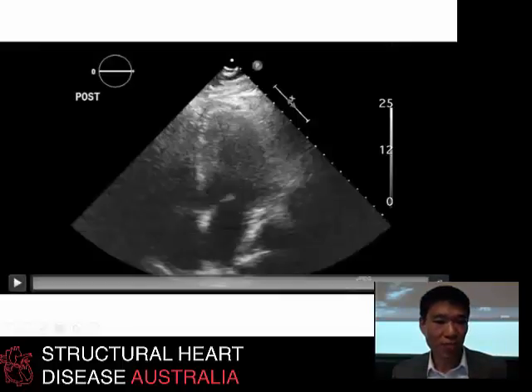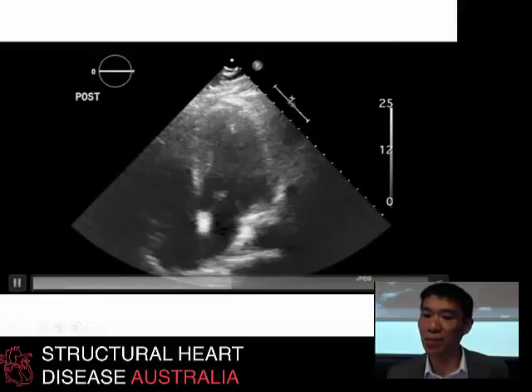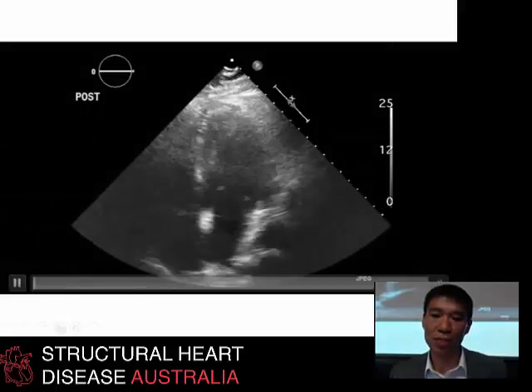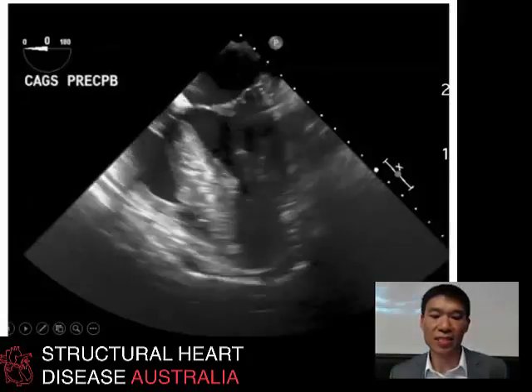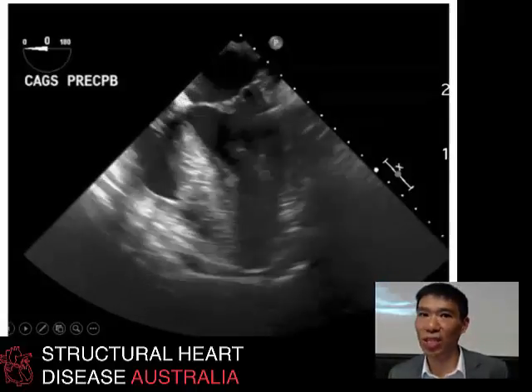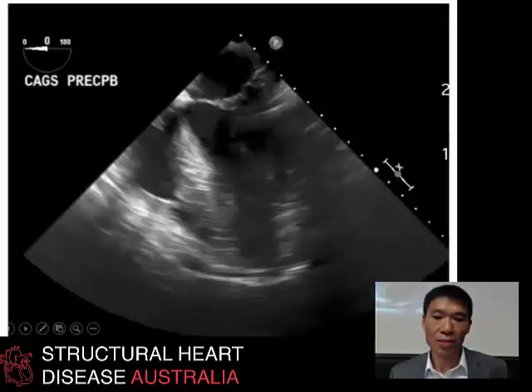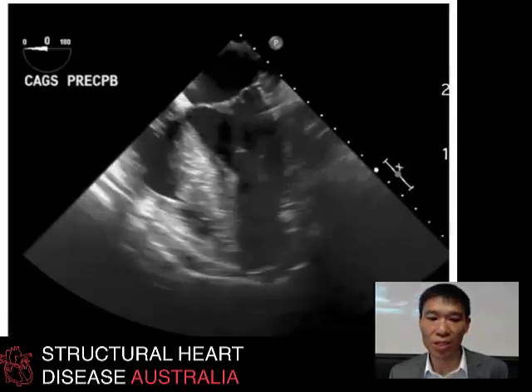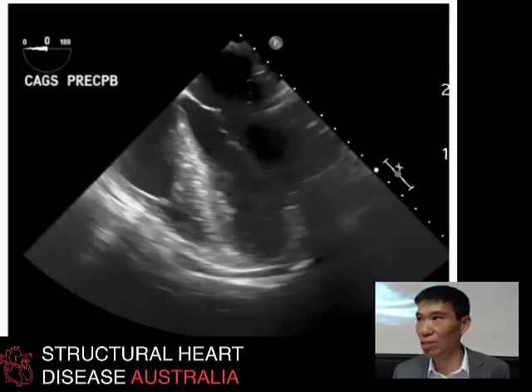This is a transthoracic four-chamber view in one patient, and in the same patient after being induced under general anaesthesia and having a transesophageal echo probe inserted, that's the same four-chamber view again. And it's obvious, looking at the same heart with the same loading conditions, that the right ventricle just doesn't look quite the same nor the motion quite the same. So there are going to be some confounders between using the same measures between transthoracic and TOE.